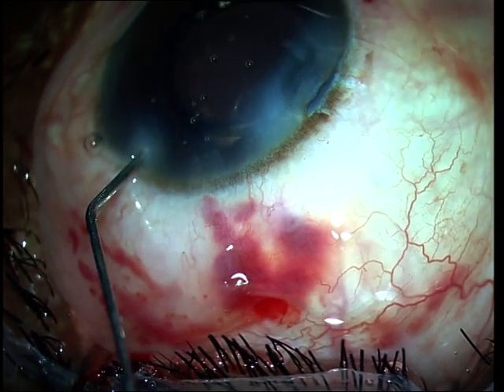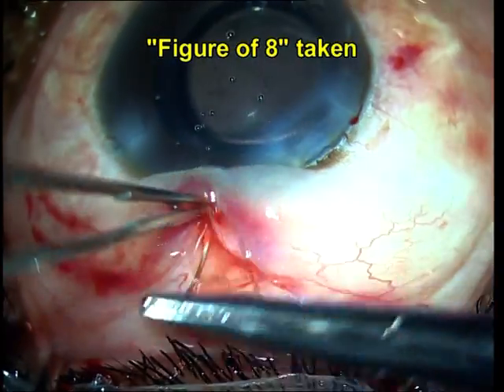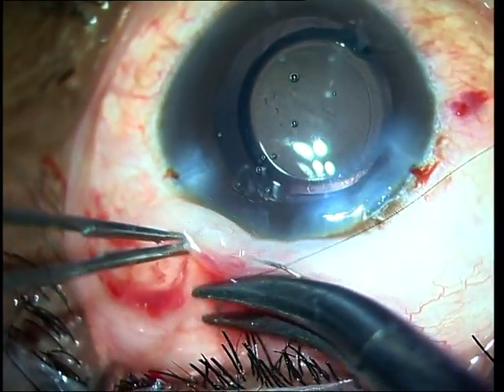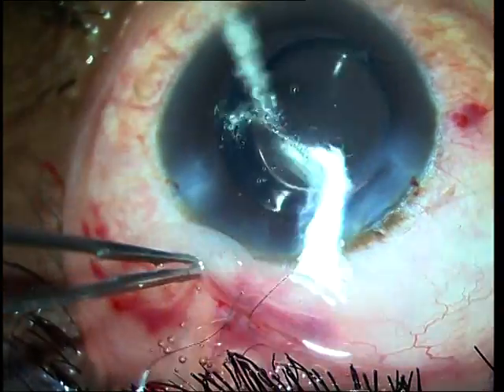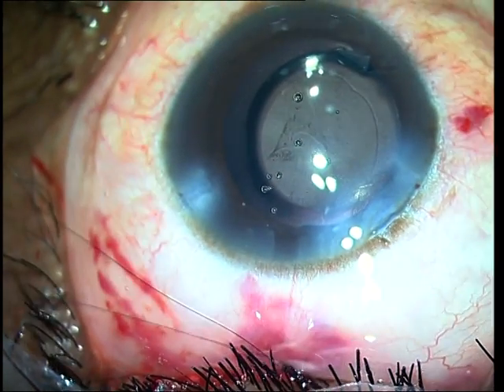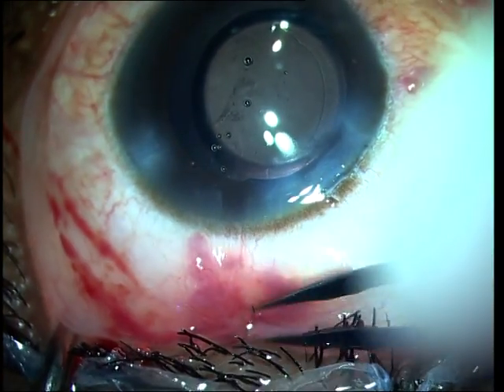Additional punches are always done after instilling additional viscoelastic into the anterior chamber so that no accidental bites are taken of the iris secondary to the iris moving forward due to a shallow anterior chamber. Again, you irrigate and confirm adequacy of leak, and once you have seen a free flow of fluid — which is the end point — the conjunctival incision is sutured and viscoelastic is removed.